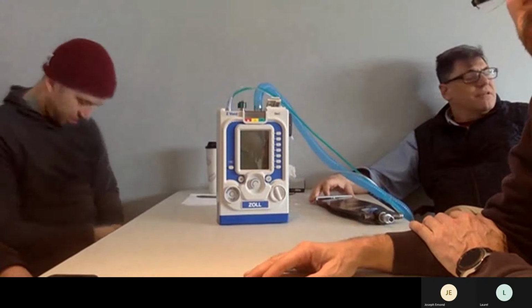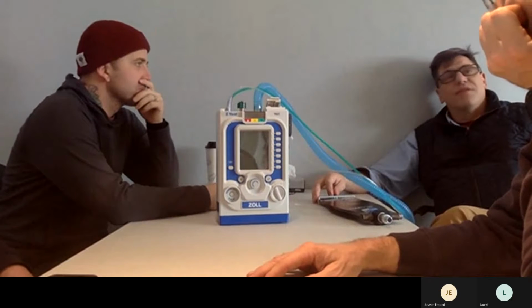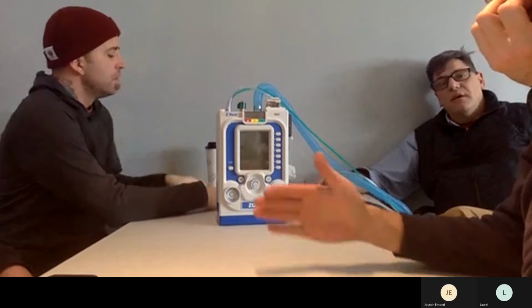All right. So now if I have CPAP, what is CPAP? Continuous. Yeah, I'm going to use this word. If I have CPAP of 5, right? And CPAP of 5 is low for sick people. And that's 5/5.